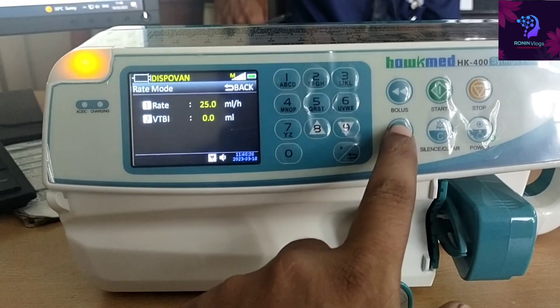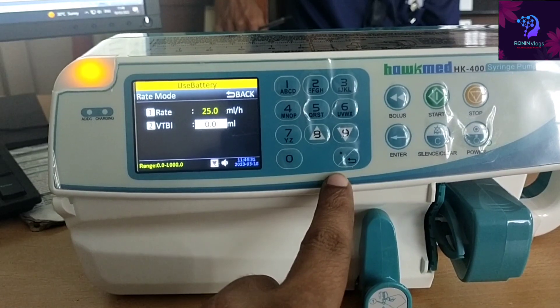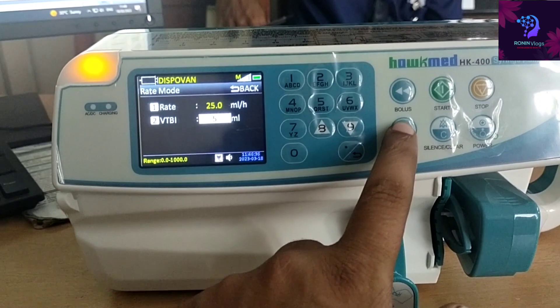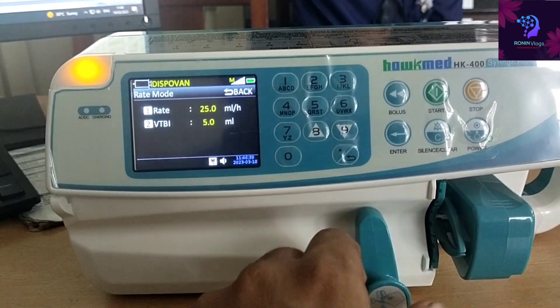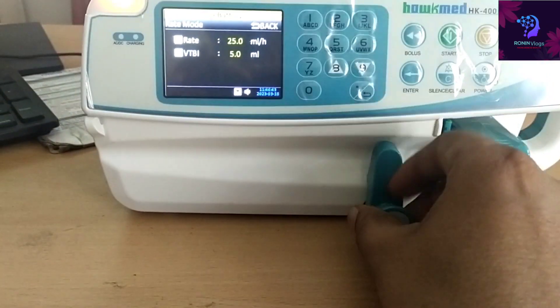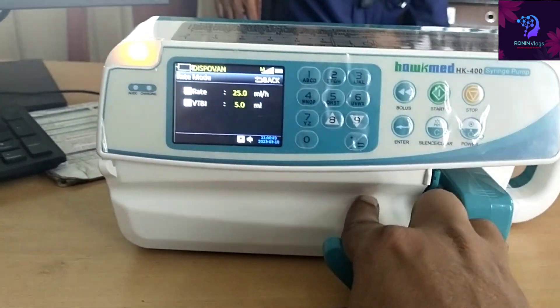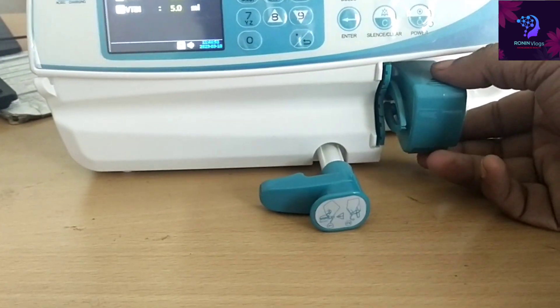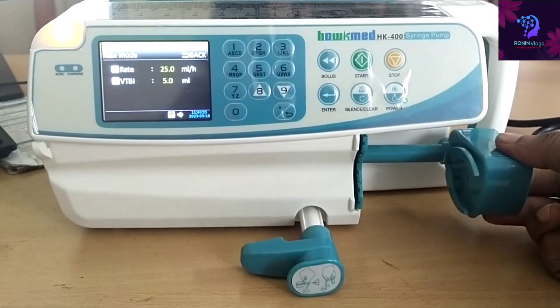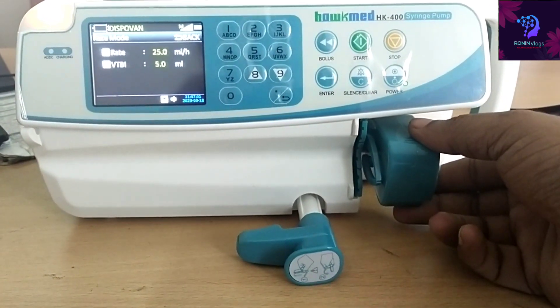We can edit the values like this. If we need to see the volume to be induced — for example, if we select 30 ml but need to give only 20 ml, we can select 20 ml. After giving the patient 20 ml, the machine will stop, and the remaining 10 ml will stay inside the syringe.